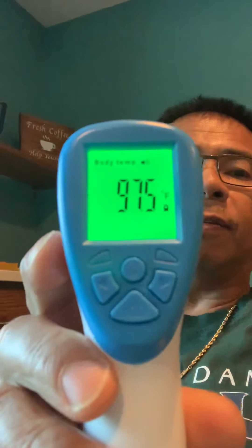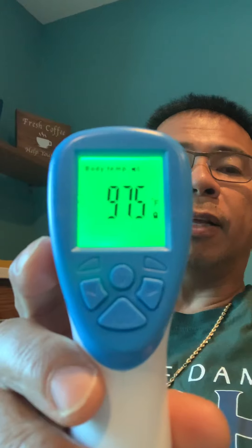To save some time in the video we put the battery in. All you need to do is press this button in the front. Point it towards your forehead about five centimeters and lo and behold it will tell you the reading — in this case it's 97.5. It is that simple.